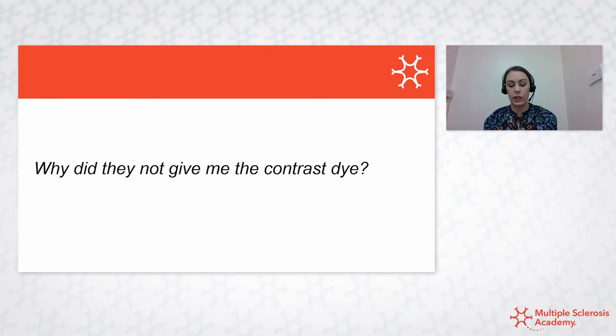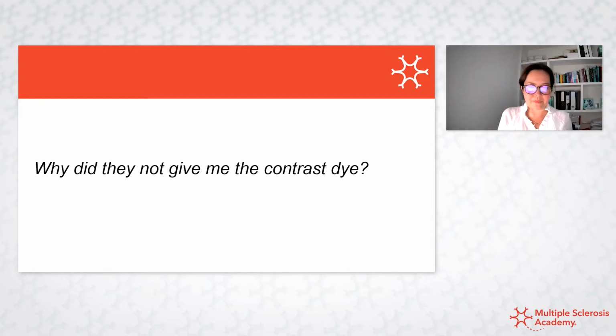When I was looking into this question, I was looking at the concern about gadolinium accumulation, and just wondered, Audrey, really whether it is a concern. I couldn't see that there was any evidence of harm to patients, but just wondered your opinion. Yeah, that's quite right, Liz.